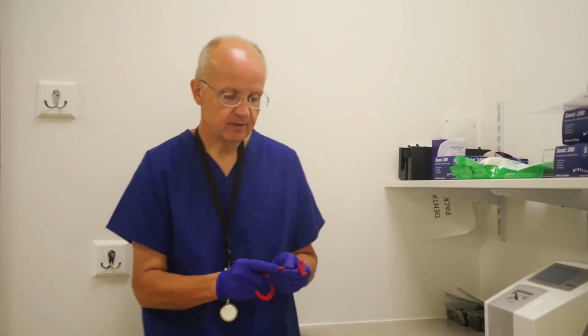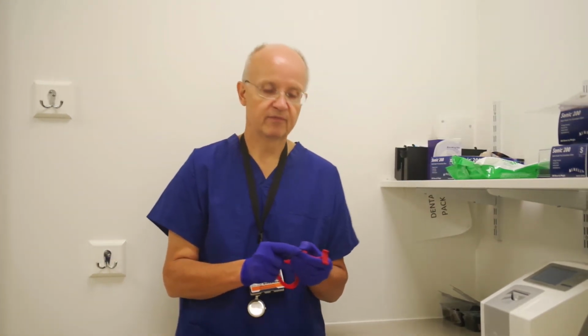Now, the other thing to mention, a very rare occurrence, but sometimes we have to do a vertical bite wing.